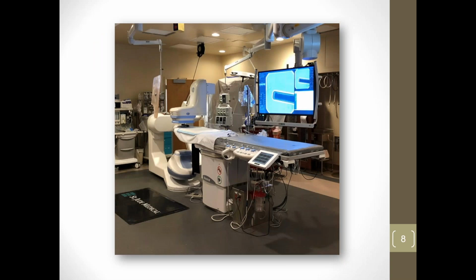So here's a more up-to-date cath lab, and like I said, I'm sorry about the lighting. So here's your screen now, and actually they're quite a bit bigger than this. This one's a few years old, so they've gotten even bigger. But yeah, the cardiologist can really get a view of what's going on.